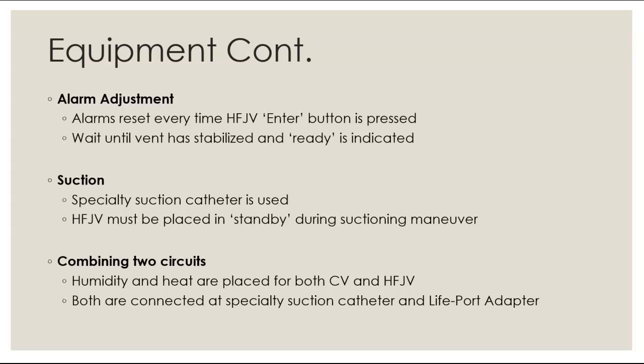So, like, if you have a big, busy kid, maybe they have a ton of secretions, you're constantly adjusting those alarms. It won't let you adjust the alarms until that ready indicator that I showed you guys in that top right corner says ready and it's indicated.